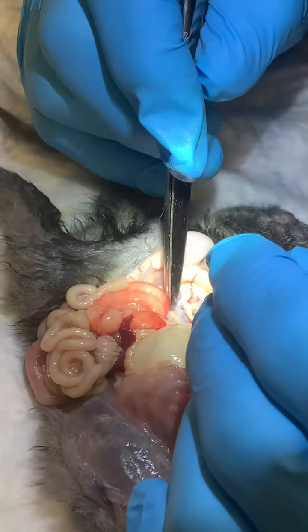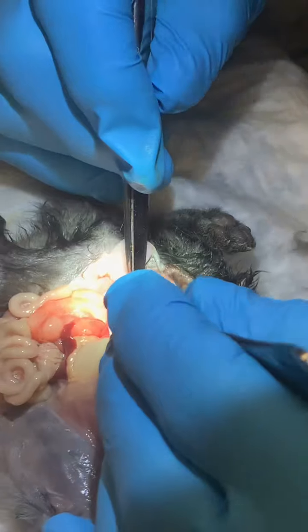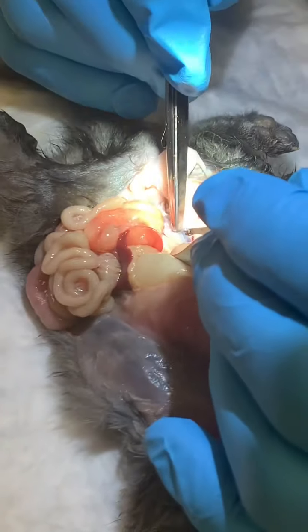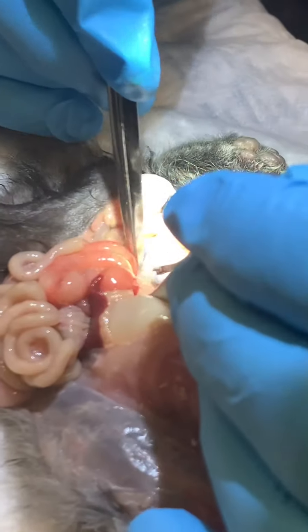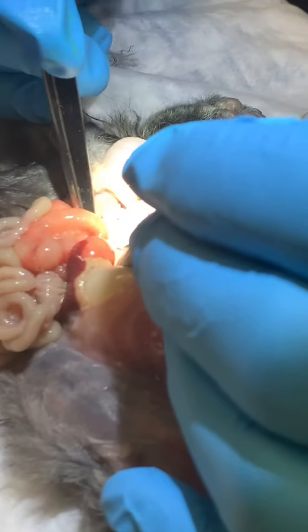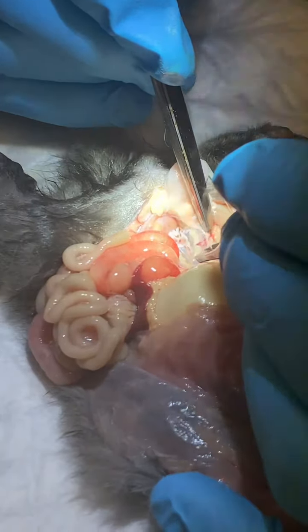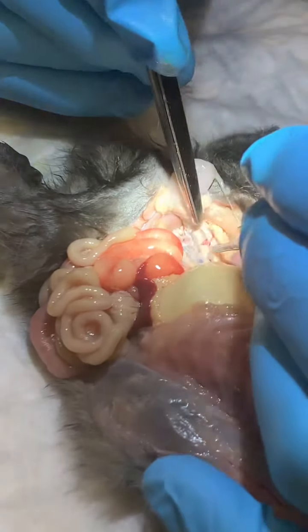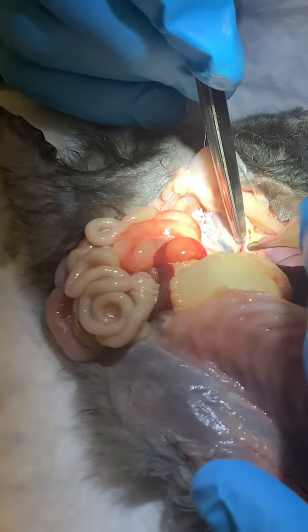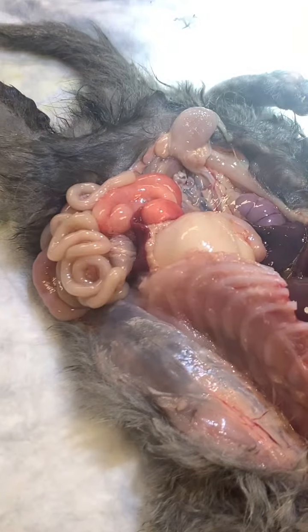And then I was looking for the lymph nodes up in here. Sometimes it's better to have a bigger patient. I don't think that's it. No, yeah. That's kind of the location of the lymph nodes. So as far as popliteal, I need them exposed.